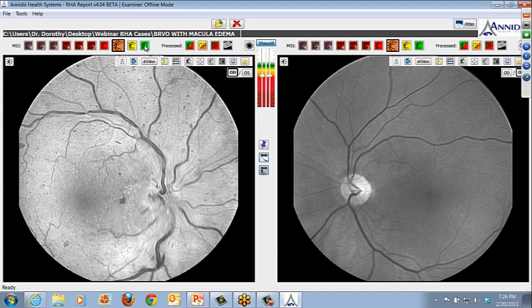And when I saw him for his eye examination, I saw these very small little nerves, and you can't appreciate it in the right eye. And I'm going to talk about the right eye momentarily. But in the left eye here, you can see he has a very tiny disc. There is no discernible cup. And the artery and the vein are in very intimate relationship with one another. A very confined space, if you will.